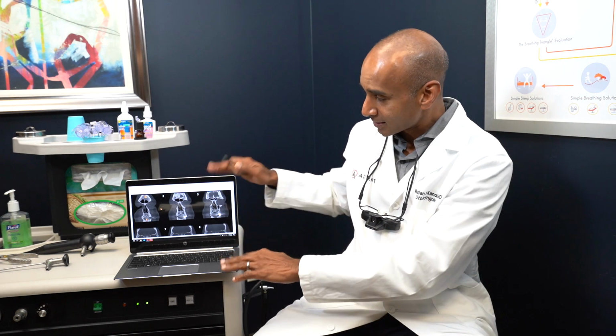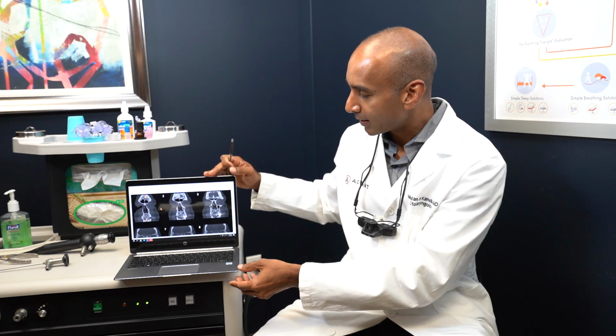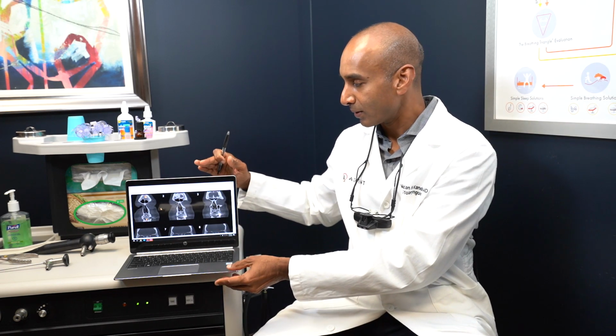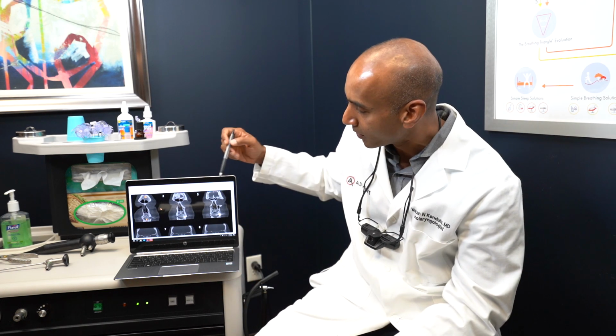Dr. Madan Kandula with Advent today talking about CT or CAT scan imaging and why it's so crucial for everything that we do here at Advent. So this is the CT, this is my computer. All of our offices have in-office CT imaging, which goes through the cloud up online here. When we do a CT on somebody, we're looking at a laptop like this and walking you through. I'll just demonstrate what I typically do, which is this.